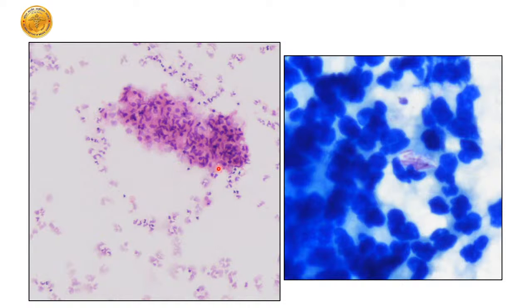Just a few images from the cases that we report. Can anybody speak out or type out what this is? If you can, unmute your mic. Excellent, Kurat says it is actually a granuloma, but there was something interesting in this patient. He was about a 56 or 57-year-old male, with neutrophils in the background. We had no history whatsoever of intravesical BCG instillation.